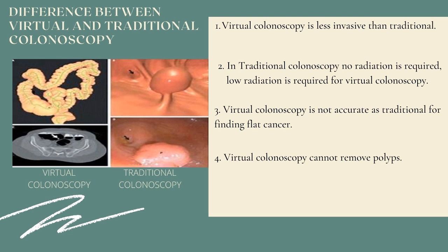The entire colon is screened in traditional colonoscopy. In virtual colonoscopy, the entire colon is screened and it also detects other issues in your abdomen. Traditional colonoscopy requires 45 to 60 minutes, whereas virtual colonoscopy requires only 15 minutes.